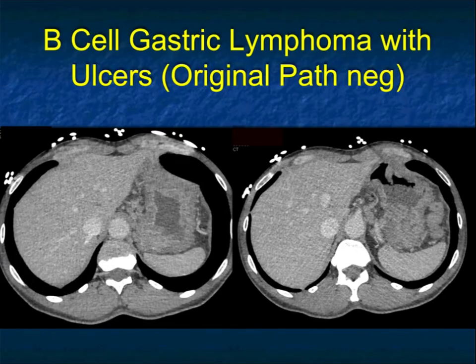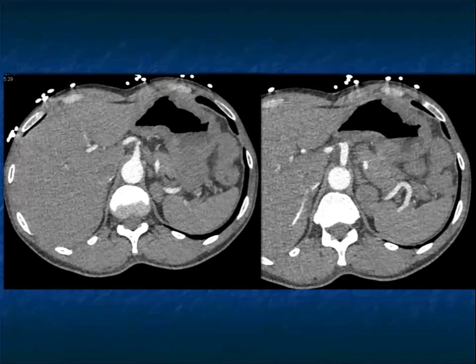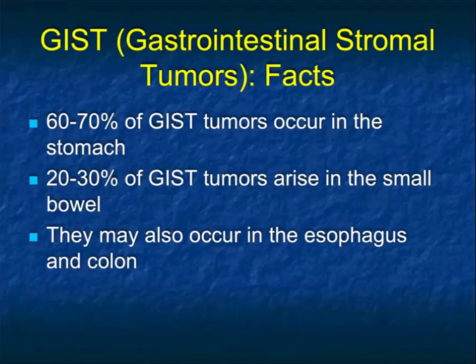On the other hand, this case has bulkier tumor infiltration with lots of nodes. You could consider adenocarcinoma, but lymphoma is a good possibility. We think about ulcers as being something with adenocarcinoma, but you can see ulcerations with lymphoma as well as with GIST tumors. The bulky tumor infiltration should at least make you think about that possibility.